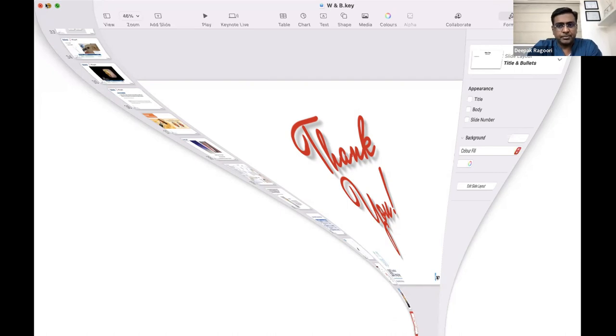Sure. Another follow-up question: can an open-ended basket be considered as one universal basket in any situation, or is there any specific indication for a zero tip? Yes, you can. Predominantly, when you're retracting the stones through the ureter without an access sheath, an open-ended basket might get tricky, because the funnel or tip of the basket stays a bit open like a tri-prong. A zero tip basket would be much smoother like a cone, which would come out through the ureter much more safely. Maybe that is the only reason. Otherwise, as far as getting hold of the stones, we can use open-end anywhere we want.